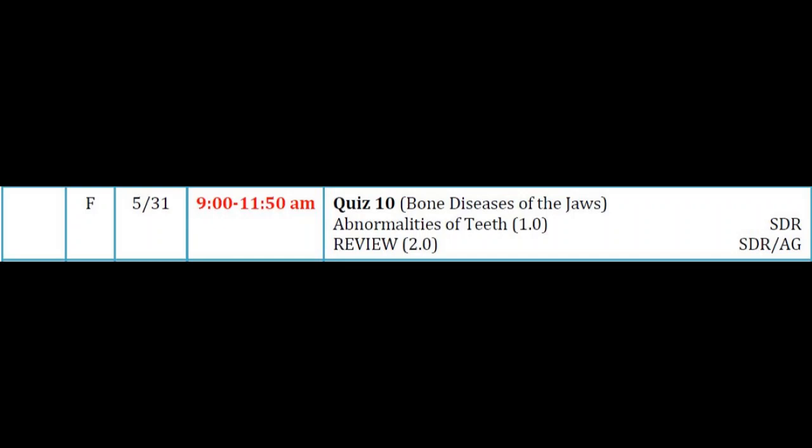So you see the amber color? And you see where the enamel has broken off the teeth because it didn't stick properly. Here we have a radiograph that is characteristic for dentinogenesis imperfecta type 1 and 2. Type 2 is classic dentinogenesis imperfecta, but on both of these you can see the bell-shaped crown where the crown of the tooth is normal, but then it constricts, and we have a small narrow root.